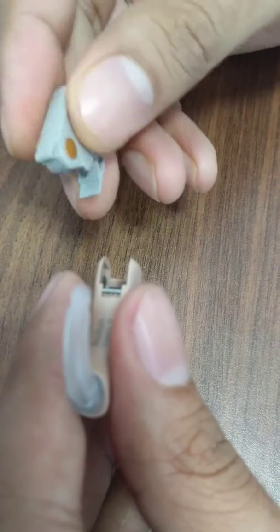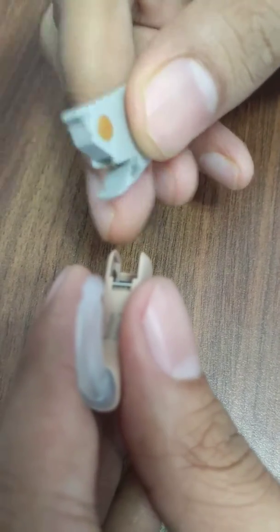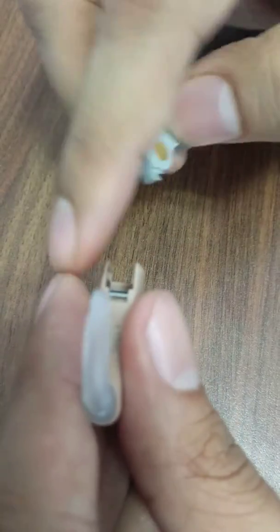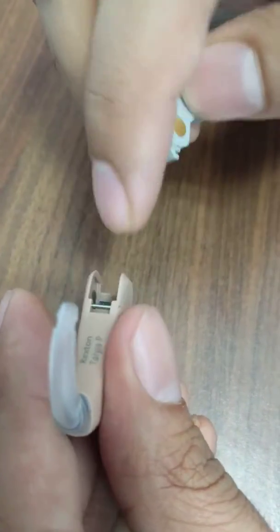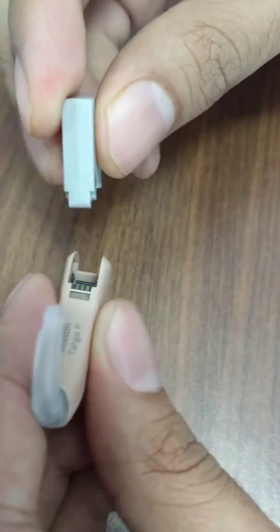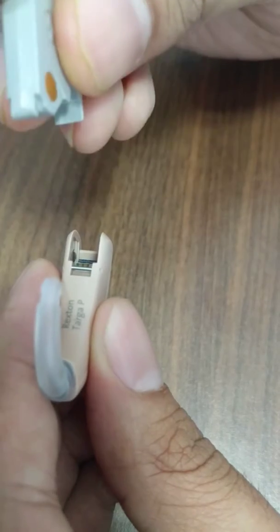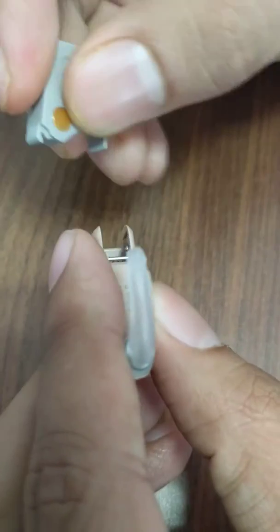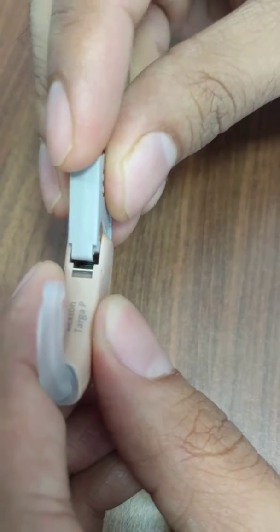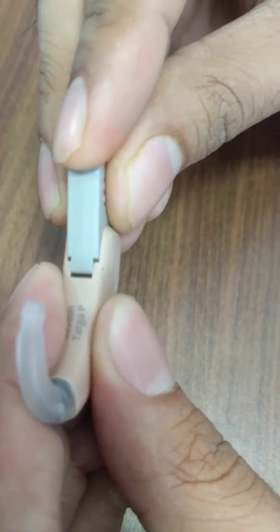Now you will take the programming adapter — it looks like this. You will see this top portion here. Hold the programming adapter so that this top portion fits into this rod over here. Hold it at a 45-degree angle, with the groove lined up.